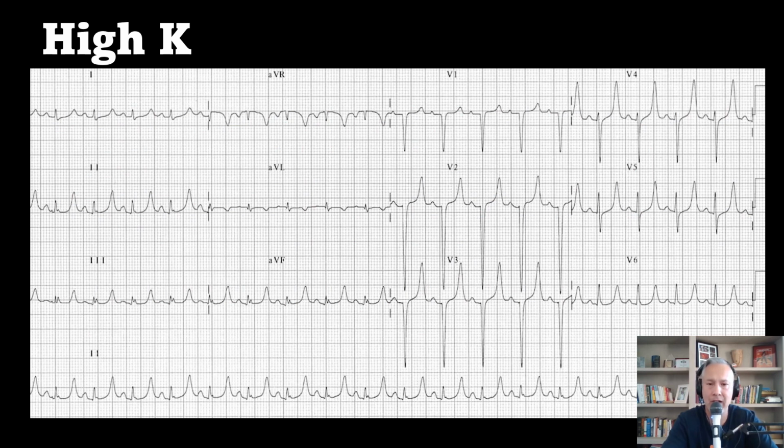Now let's talk about hyper K or high potassium. Look at the difference between these T waves and the T waves of occlusion. These T waves are dagger-like. They're sharp, pointy. I mean, it looks like if you sat on them, they would skewer you, right? Hyperkalemic T waves are tall and pointed.